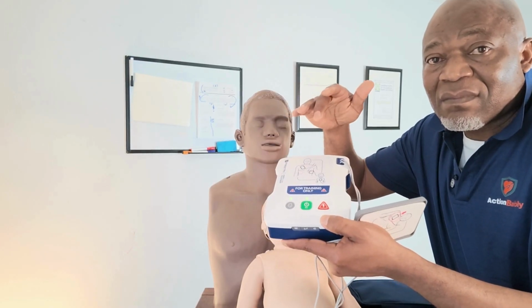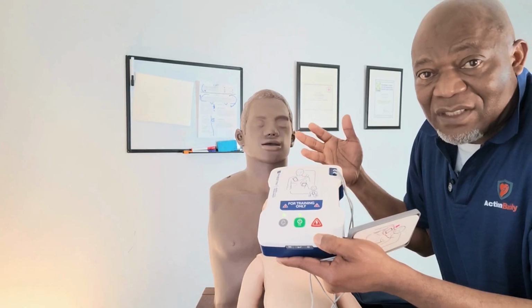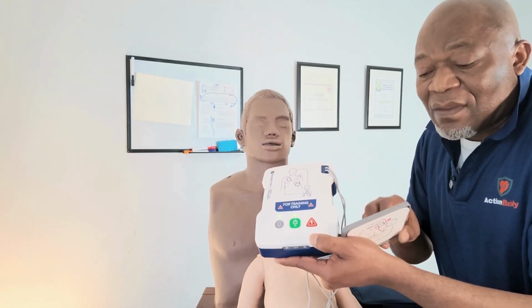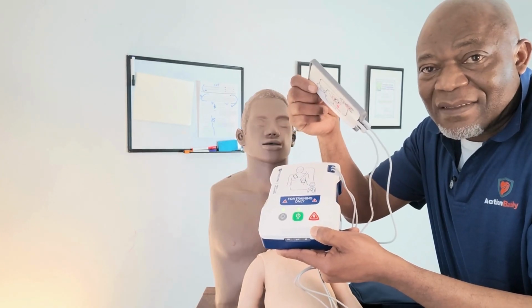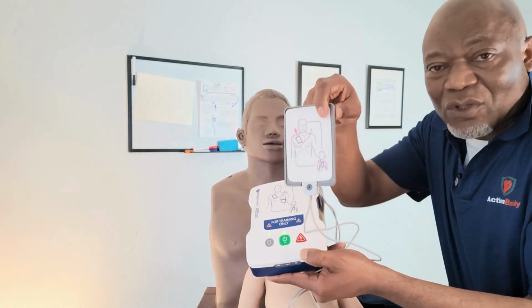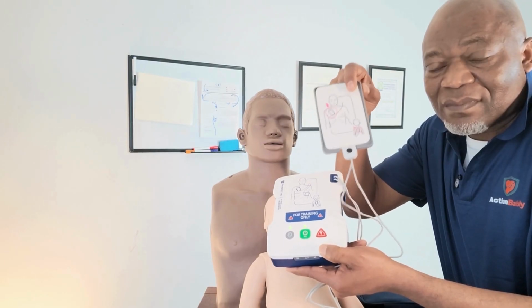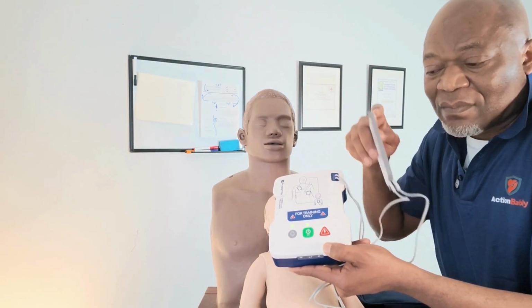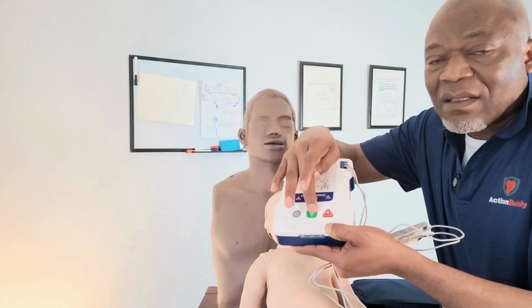Child patient. Remove the child's shirt. Remove the child's shirt. Remove packet and apply pads onto child's bare skin. It's telling me to remove pack and apply pad. Apply pads to child's back and chest as shown in the pictures. Yes, as shown in the picture. Remove packet and apply pads onto child's bare skin. Apply pads to child's back and chest as shown in the pictures.